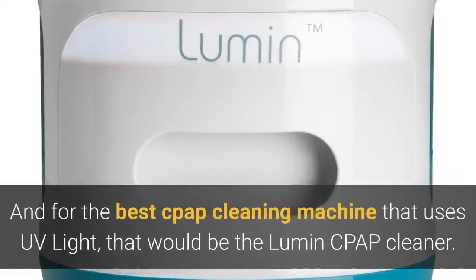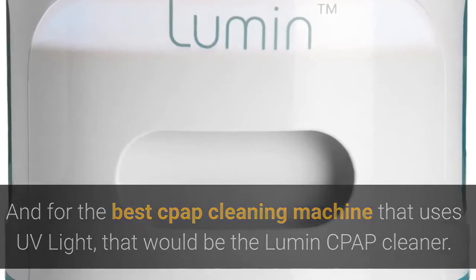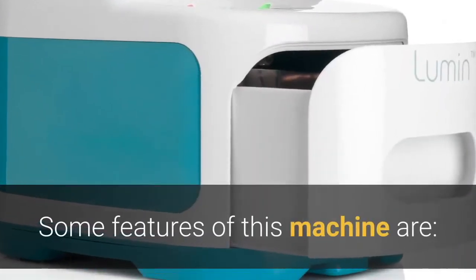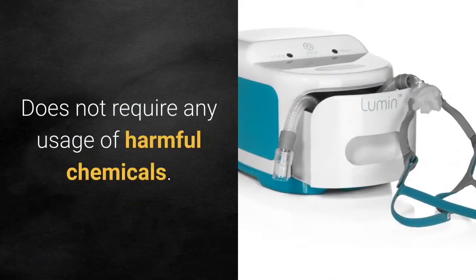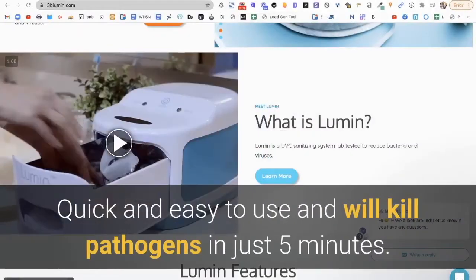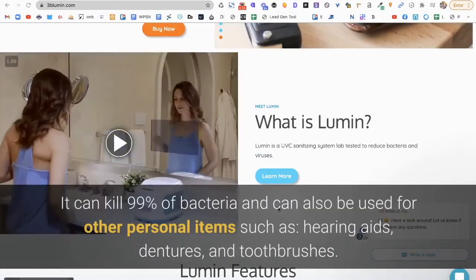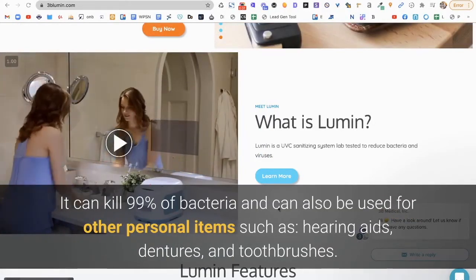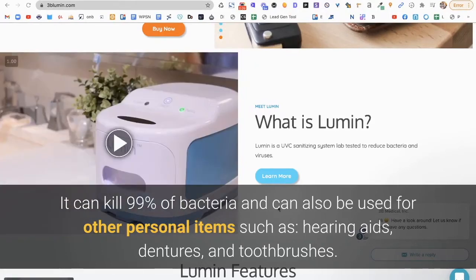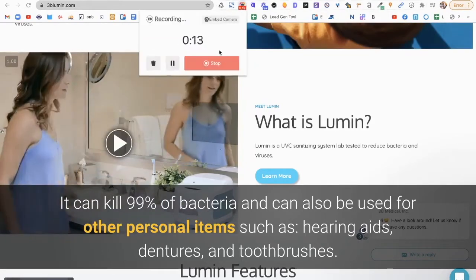For the best CPAP cleaning machine that uses UV light, that would be the Lumen CPAP cleaner. Some features of this machine are: it does not require any harmful chemicals; it's quick and easy to use and will kill pathogens in just five minutes; it can kill 99% of bacteria and other pathogens; and it can also be used for other personal items such as hearing aids, dentures, and toothbrushes.